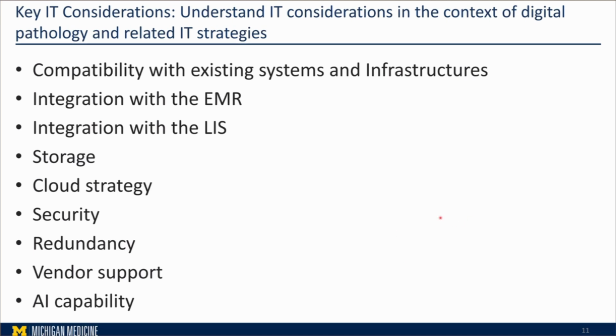Are we going to integrate this platform with the EMR and the lab information system, or maybe only with the lab information system? What is our storage strategy? Are we going to have an on-prem or cloud strategy, etc.? Security is extremely important. Redundancy, of course, and maybe a disaster recovery policy that you have to take into account.